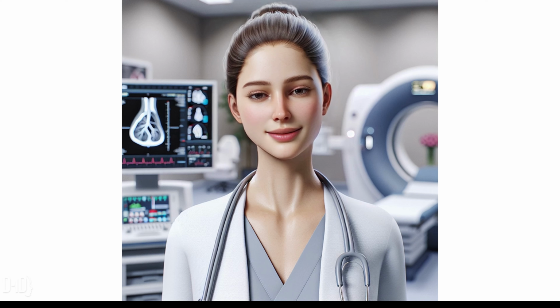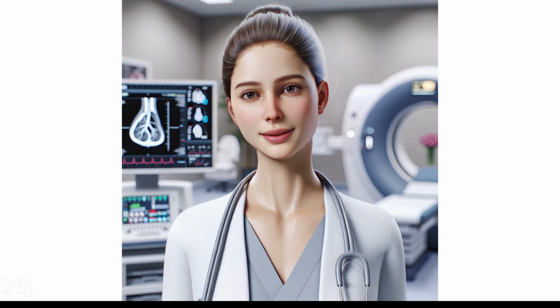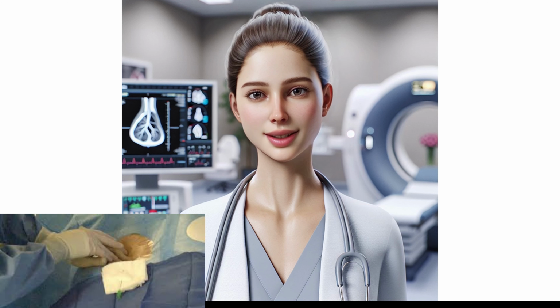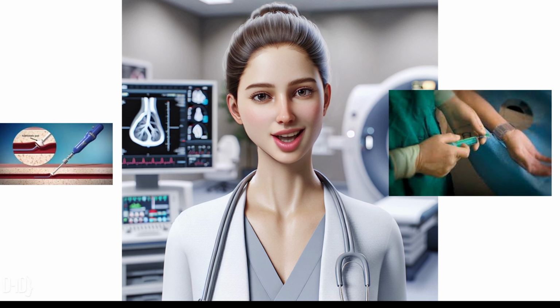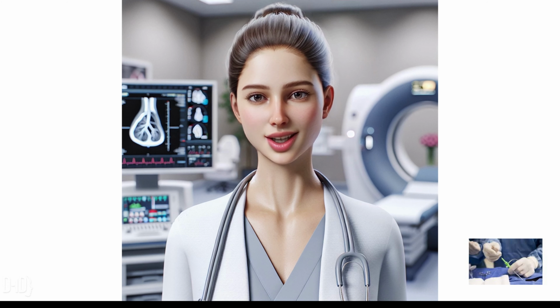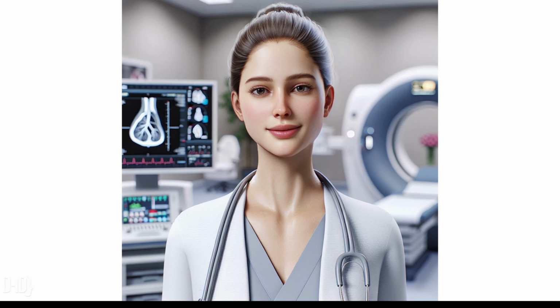Removal of the catheter. After the necessary images are obtained, the catheter is slowly withdrawn from the femoral artery under fluoroscopic guidance. Hemostasis and closure. After the catheter is removed, the femoral puncture site must be closed. Direct pressure is applied to the site for several minutes to stop any bleeding. In some cases, a closure device is used to seal the artery more securely, which may involve a collagen plug or sutures. If no closure device is used, manual pressure is applied until bleeding stops.